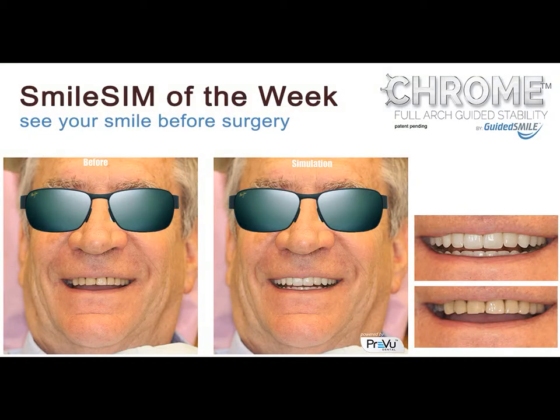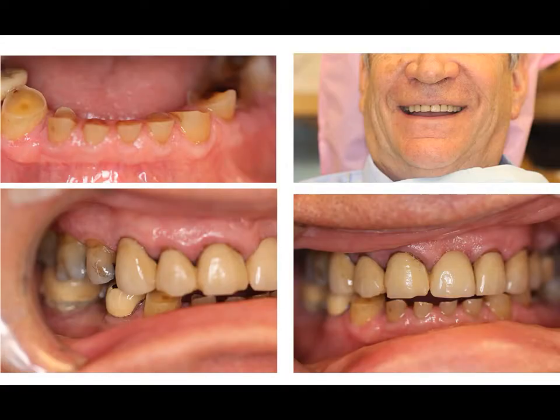Thank you, Dr. Gottesheim, for sharing images of your surgery. We're going to turn them into a mini educational video. The doctor submitted photographs, DICOM, and digital impressions to Roe for workup of a chrome case. We spent the next 5 days preparing for the online meeting, which we're going to share with you.